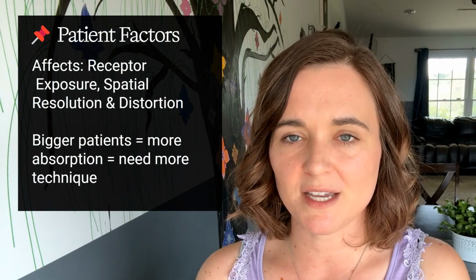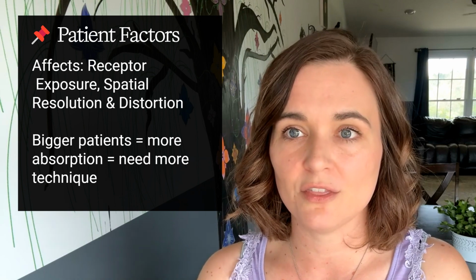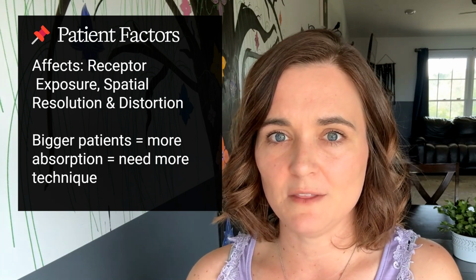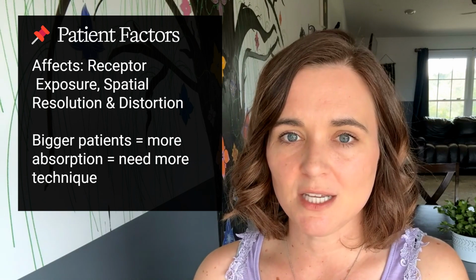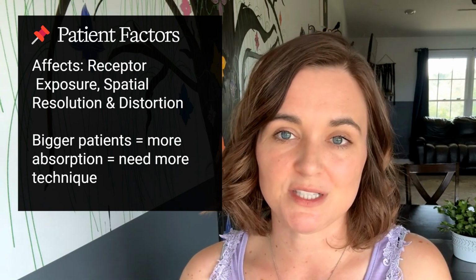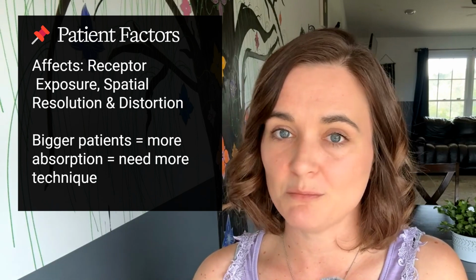Patient factors. Your size and pathology affect all three. The bigger the patient, the more absorption you need and the more technique. Pathology can increase or decrease attenuation. Here's an example. Osteoporosis uses less technique. A pleural effusion needs more.